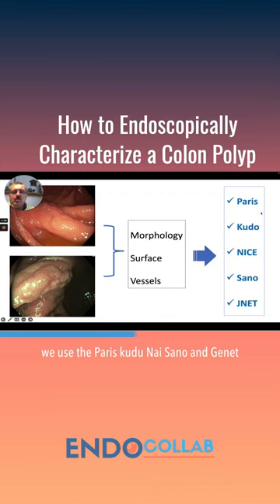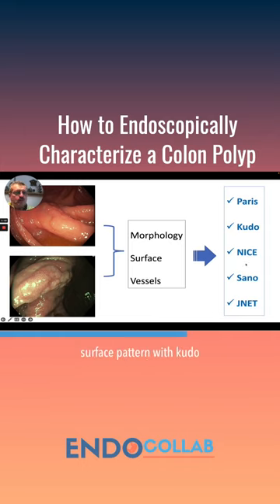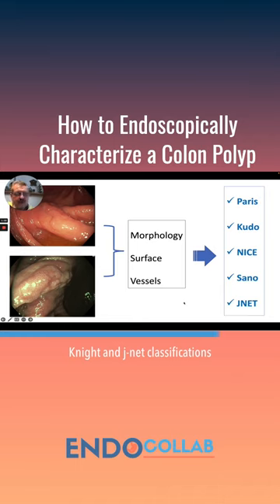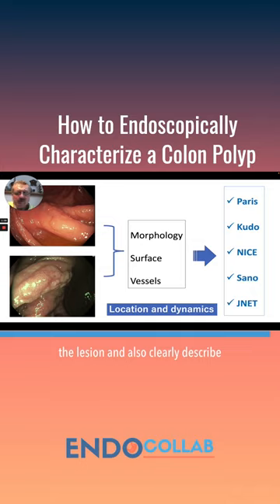We use the Paris, Kudo, NICE, SANO, and JNET classifications, but mainly focus on morphology with Paris, surface pattern with Kudo, and vessel evaluation using the NICE and JNET classifications. I also like to do dynamic evaluation of the lesion, and also clearly describe location and resection.